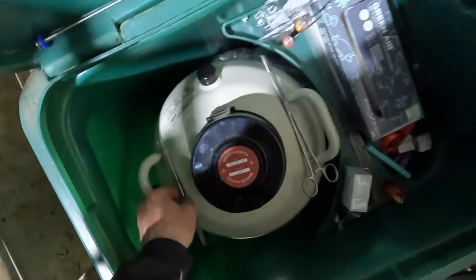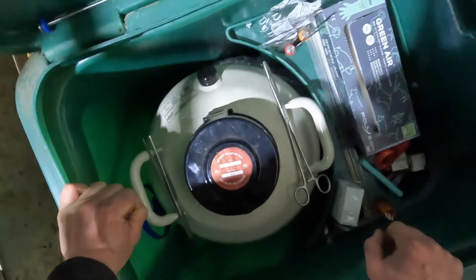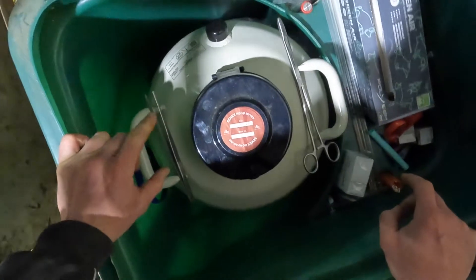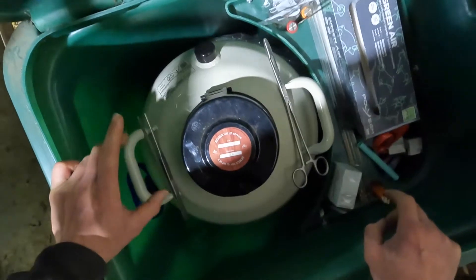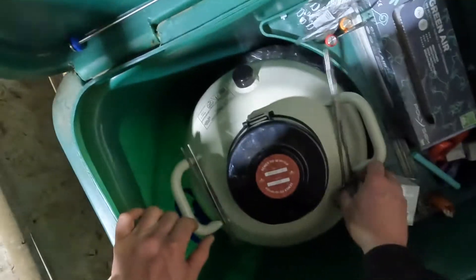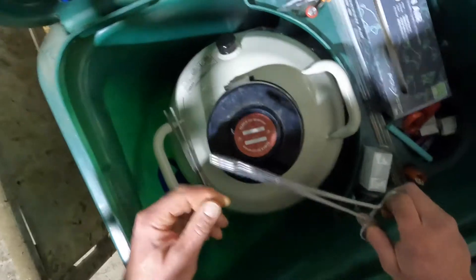I hope the initial AI gun prep and service video was a help to you. As a bit of an addition to that, and to give a bit of context to some of the things that I've put in the kit I've got for sale, I thought I'd just explain how and where I use haemostats or forceps.